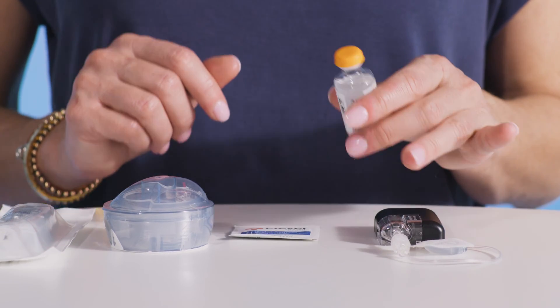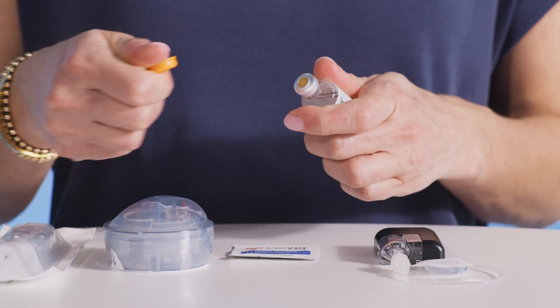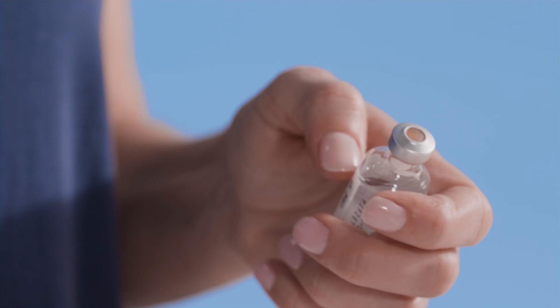Be sure you don't remove the old cartridge from your pump until you're prompted to during the load cartridge process on the Tandem Mobi mobile app. Removing the cartridge early could damage the piston on the pump. Always make sure your hands are clean and you've swabbed the top of the vial with alcohol.